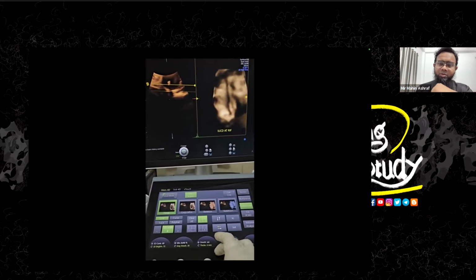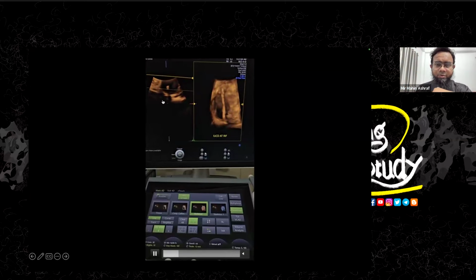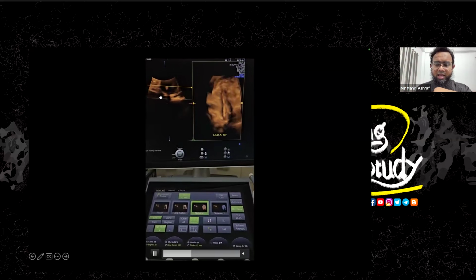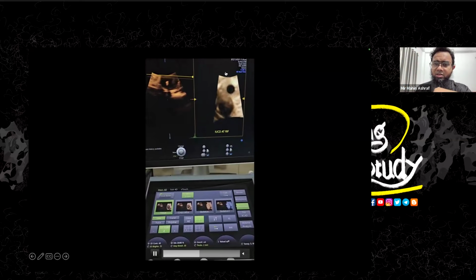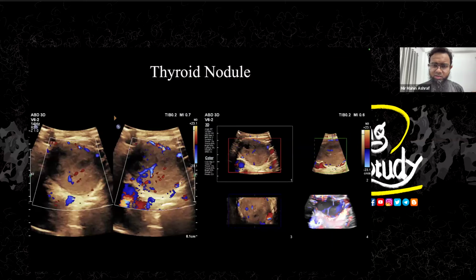Now, when the patient came to me, I found it here and I just searched it with the OmniView option. You can see there is a granuloma formation here, and I have just scanned through this area, and you can see this intrauterine contraceptive device within the right iliac fossa, forming a cavity surrounding it. Okay, so we have this OmniView option, and you can see it from different angles you want.